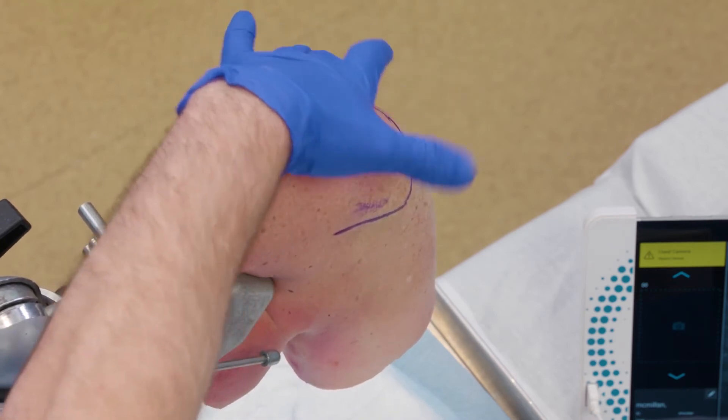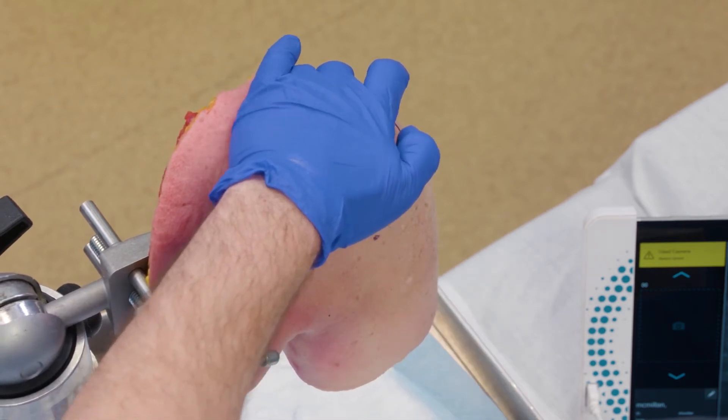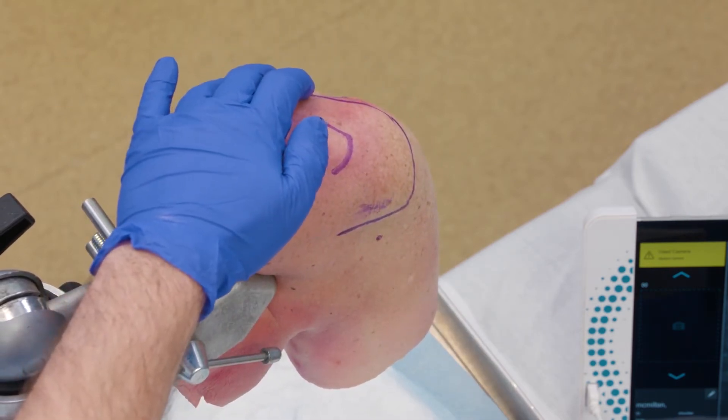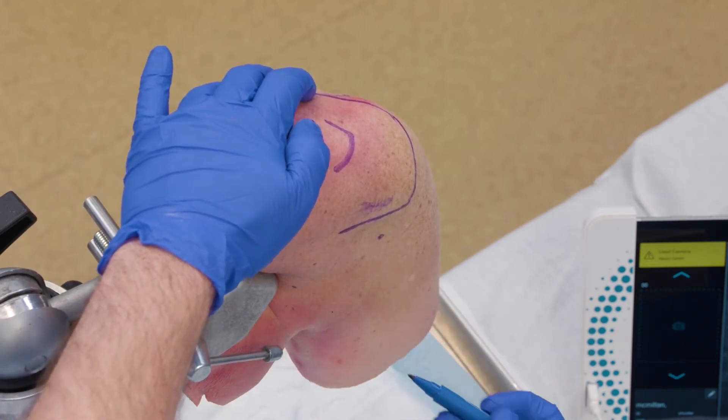I'll swing around with my finger on the coracoid and find that soft spot — that's where you're going to be coming in. Remember, this is not a 30-degree scope, this is a 0-degree scope, so you want to come in maybe a little bit higher than you would normally if you're doing an arthroscopy.